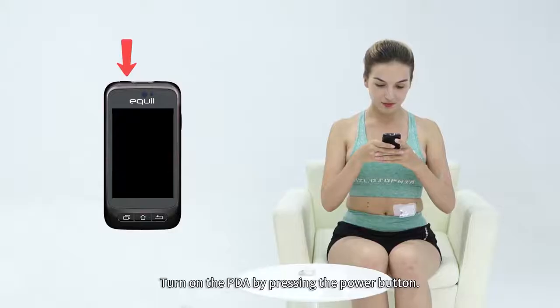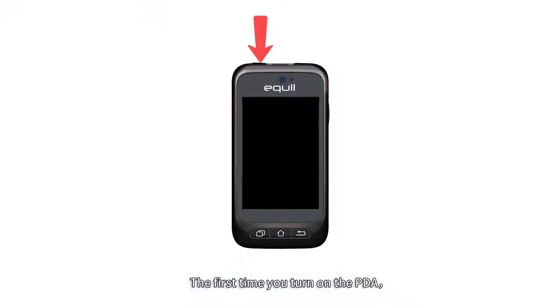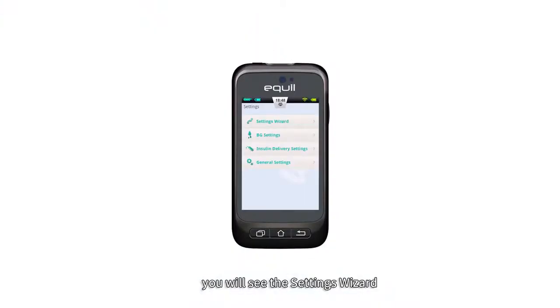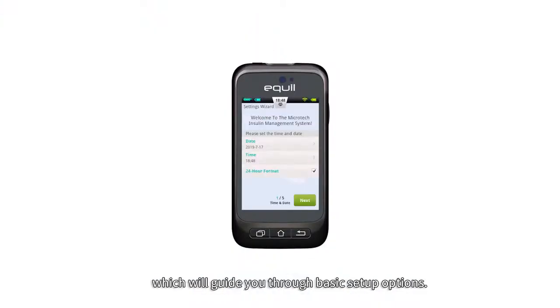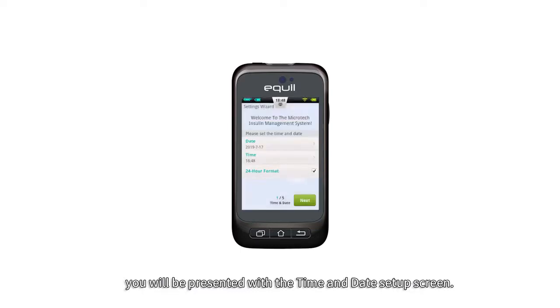3. How to set up the pump? 1. PDA Settings Wizard. Turn on the PDA by pressing the power button. The first time you turn on the PDA, you will see the Settings Wizard, which will guide you through basic setup options. After entering the Settings Wizard, you will be presented with the time and date setup screen. Recommend to choose 24 hours.